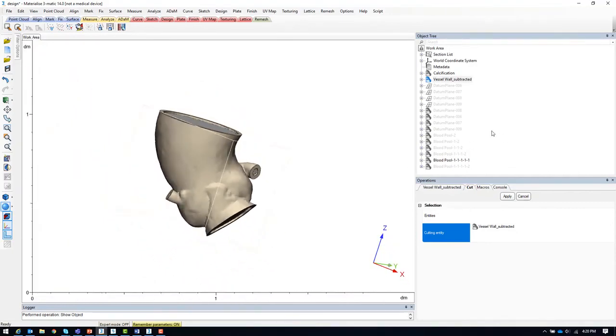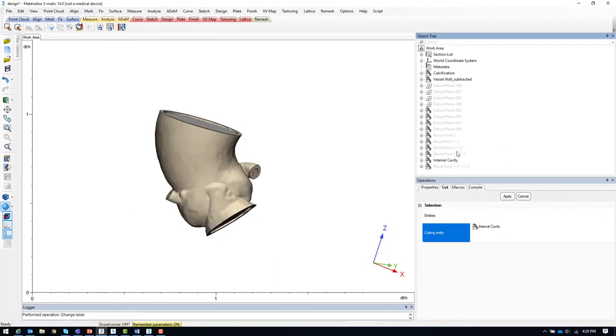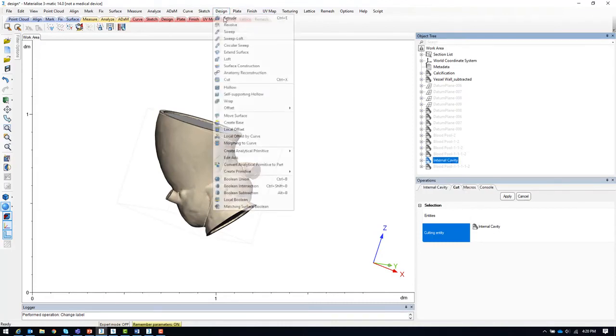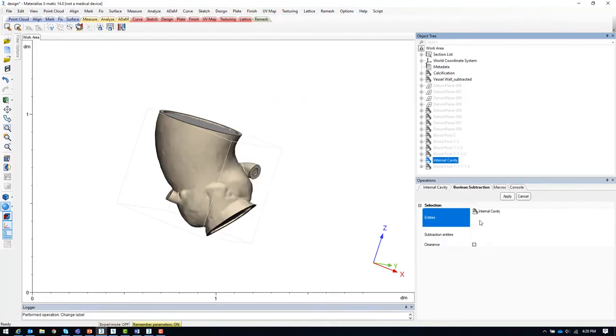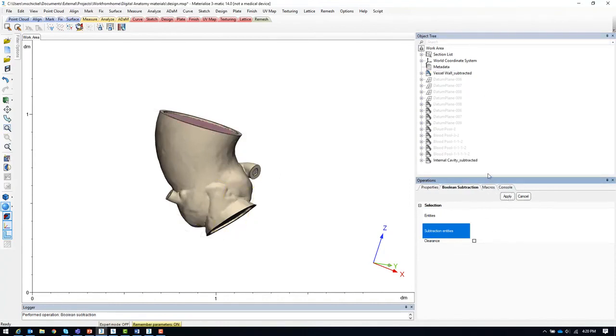A final step would be to ensure that this new internal cavity does not have any intersections with any of the other STL files that we are planning to print. In this case, we should do a final Boolean subtraction between the internal cavity model and the calcifications since this wasn't accounted for in the original blood pool model.